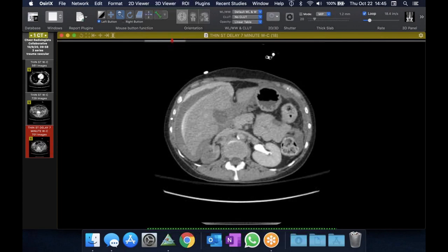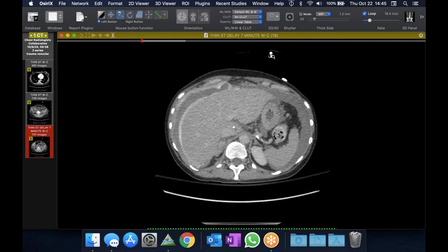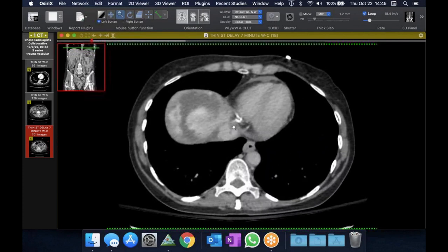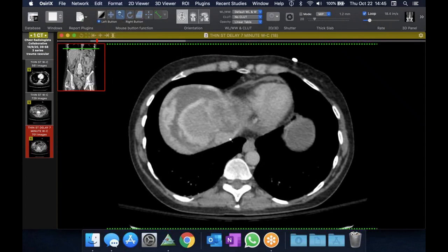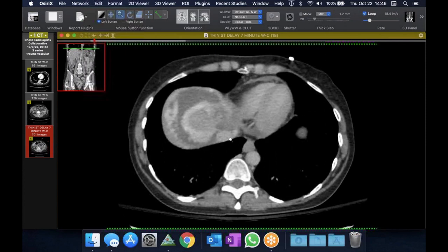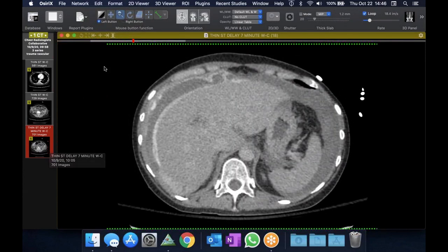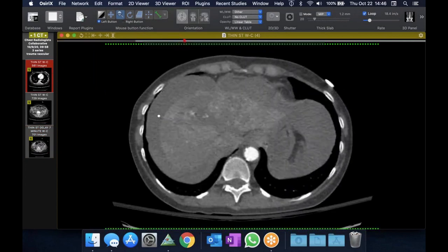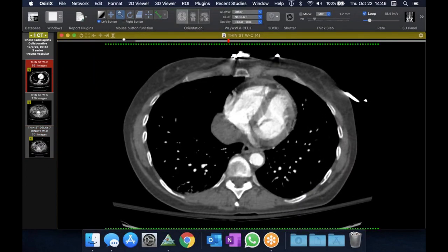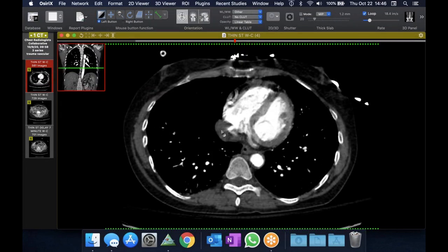As you can imagine, this is a tough place to operate. The IVC is very thin and hard to get to in that area. Most of these patients don't even survive to the hospital because they bleed so much. The whole IVC was avulsed here from the junction with the right atrium and the liver, but it's harder to perceive on the chest CT because you're so early in your contrast phase. It's just too much tissue right around that junction. If you window it a little bit, you can see it doesn't look quite normal there.